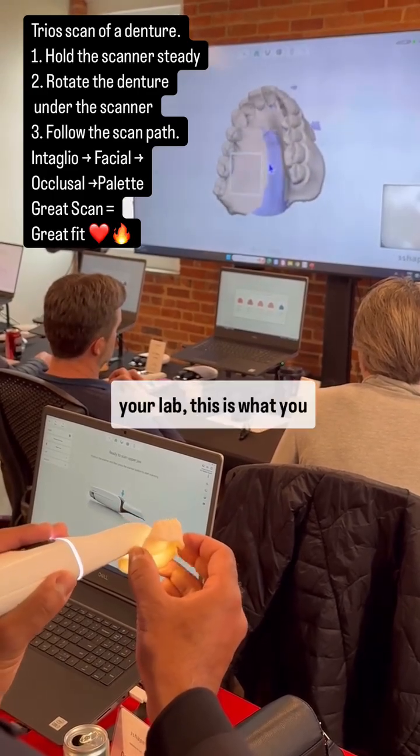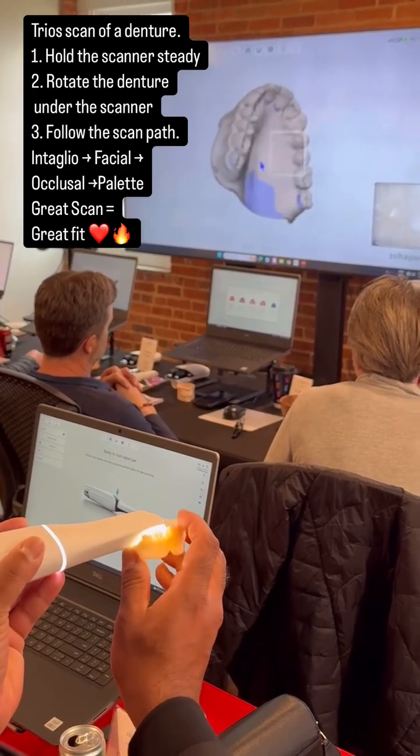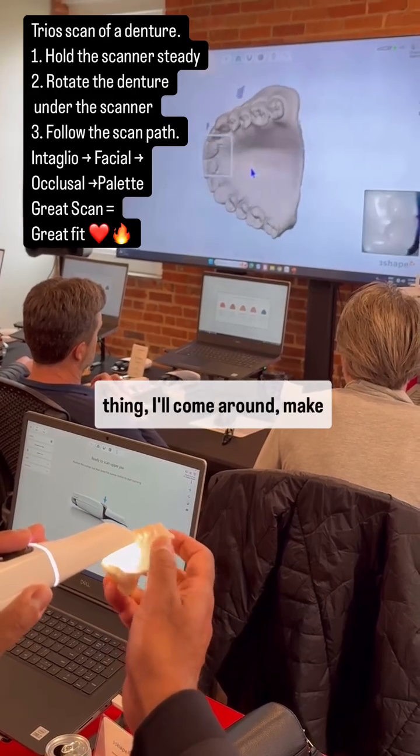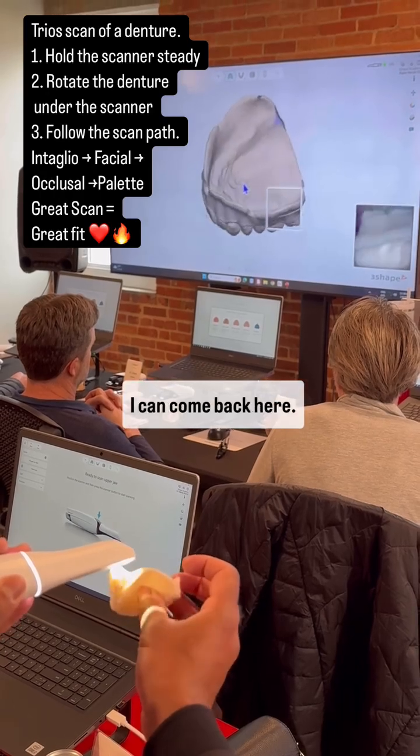If you're going to send to your lab, this is what you have to know how to do really well. Okay, after I get the whole thing, I'll come around and make sure that I have it all. I pretty much do. I can come back here.